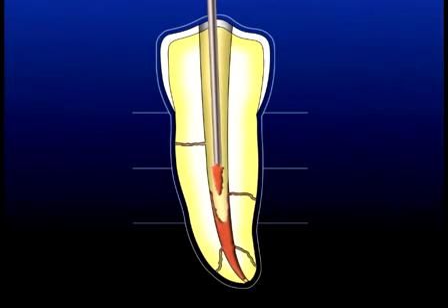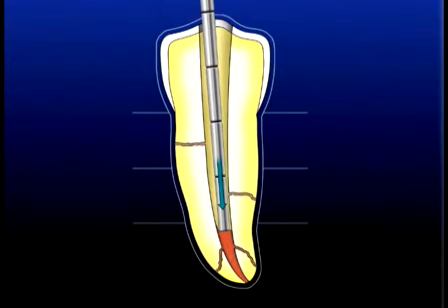Following the final heating and gutta-percha removal cycle, the transfer of heat is progressive into the apical 1/3 of the gutta-percha master cone. The smallest pre-fit plugger can predictably deliver a thermosoftened wave of gutta-percha into the narrowing cross-sectional diameters of the canal, resulting in apical corkage. Sustained vertical pressure with the plugger during the gutta-percha cooling cycle will effectively offset any potential for shrinkage and allow for controlled, predictable apical obturation.